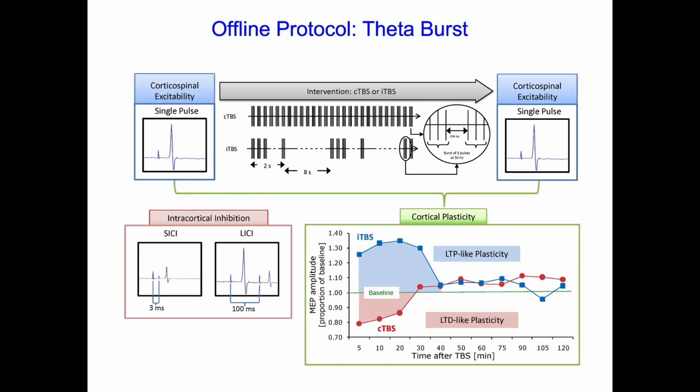Another kind of offline protocol is, again, that theta burst that I've talked about a few times. If I do a pre-post measurement, that's what you do offline, just like the paired associate, I do pre-post with a motor evoked potential. Here I'm doing that again.